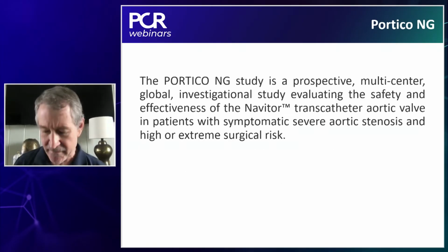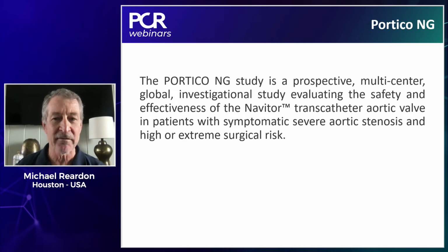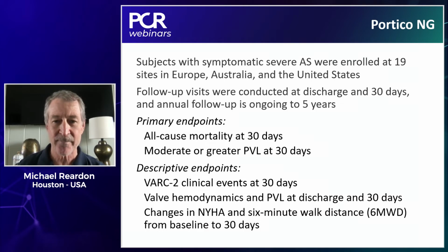The first data that we're going to talk about for the Navitor valve is the Portico NG study. It was a prospective, multi-center, global investigational study evaluating the safety and effectiveness of the Navitor current generation transcatheter aortic valve in patients with symptomatic severe stenosis and high or extreme surgical risk. I had the opportunity to run this trial with Professor Søndergaard. This was a global study that included the US, Europe, and Australia.